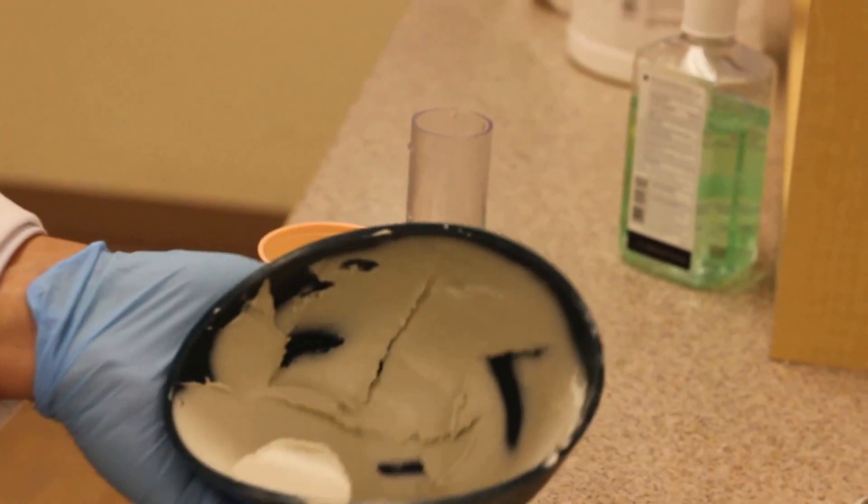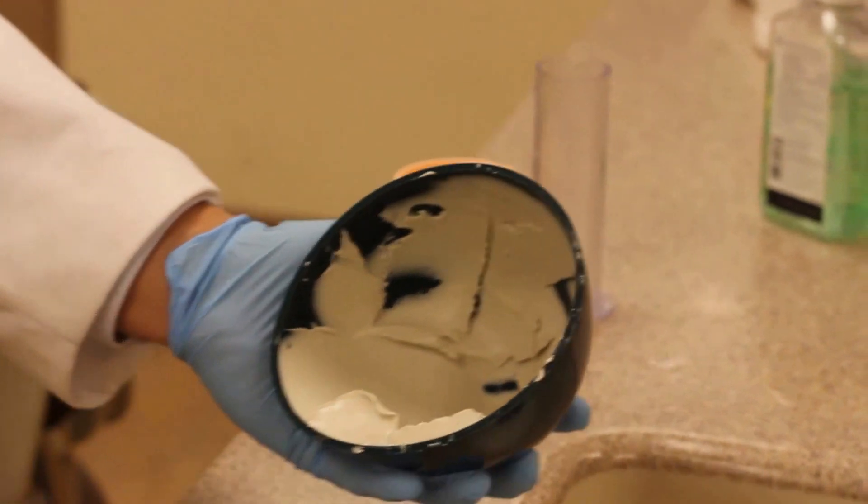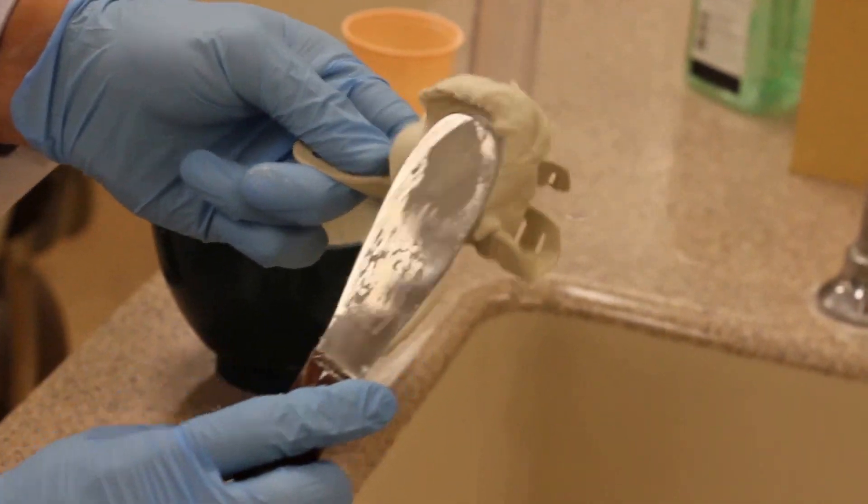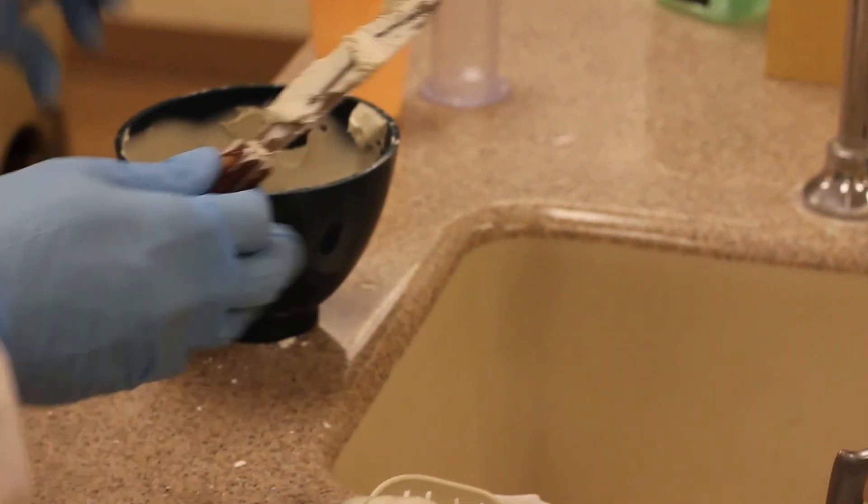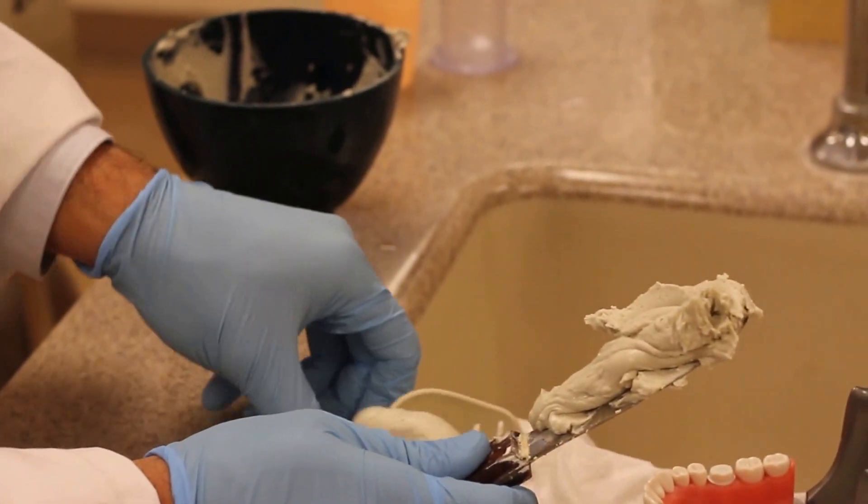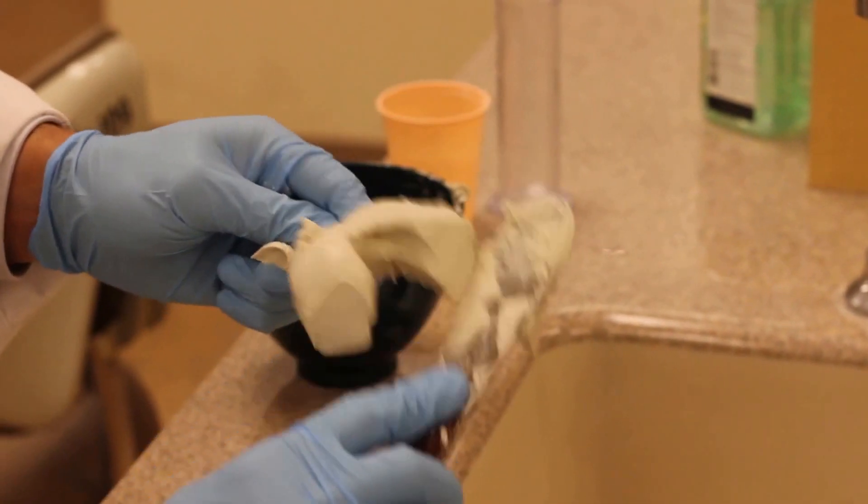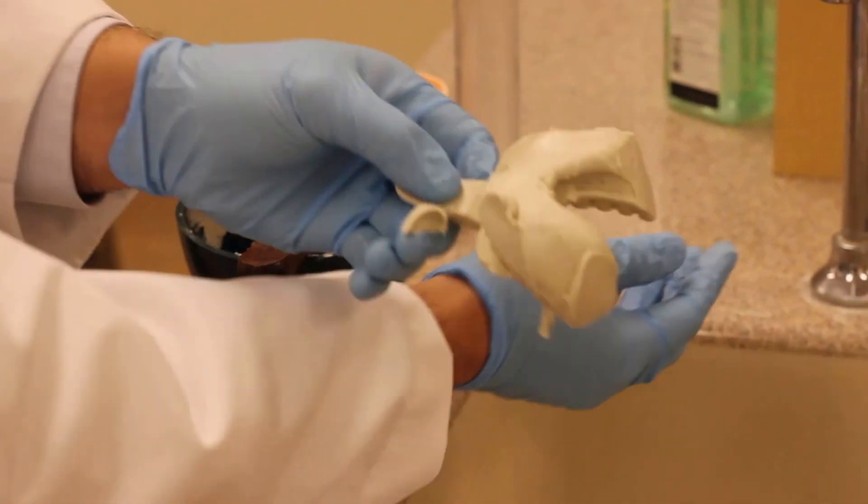And for the lower arch I'll generally pick up about half of the alginate, load it in half of the tray, come back for the other half, and load it in the other half.